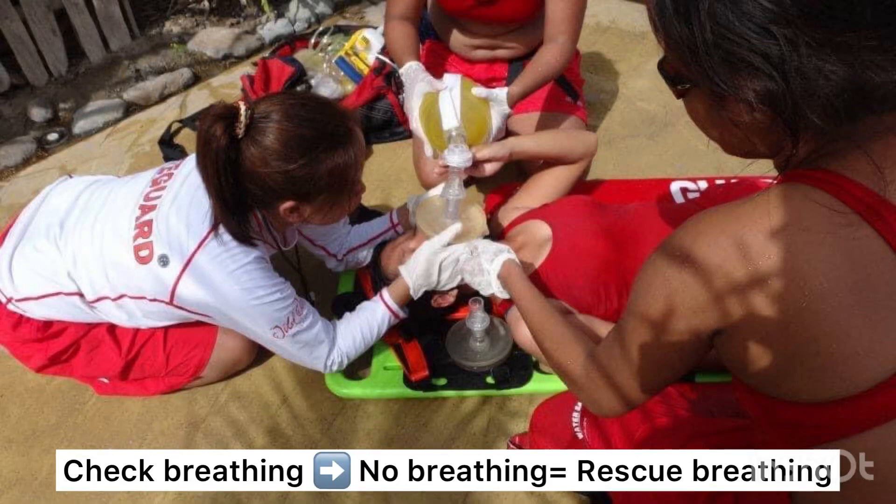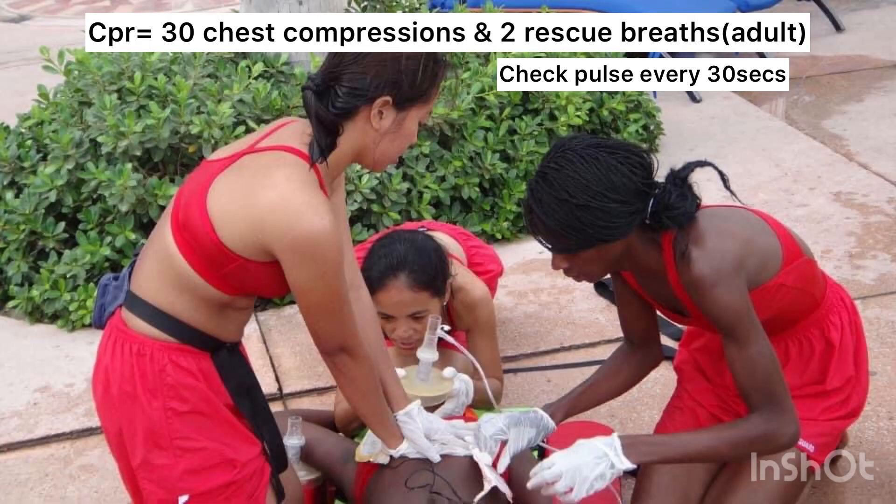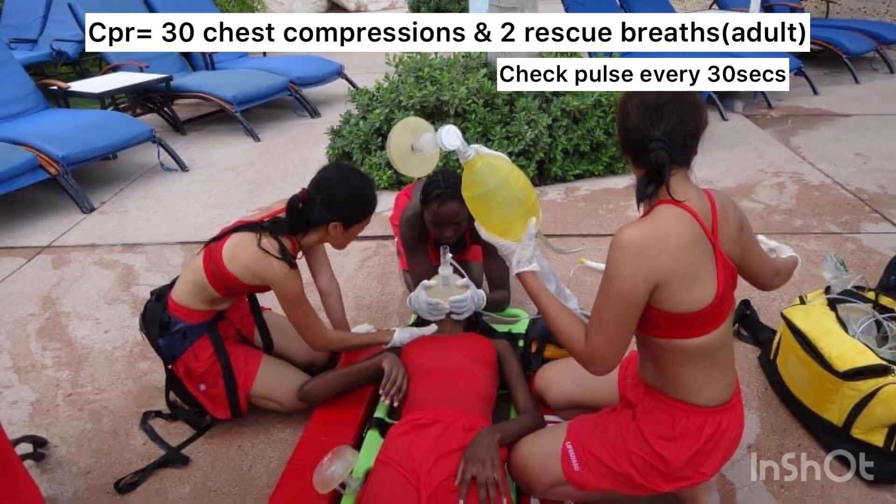Check breathing. If there's no breathing, do rescue breathing. Check pulse. If there's no pulse, start CPR. CPR equals 30 chest compressions and two rescue breaths for an adult. Check pulse every 30 seconds.